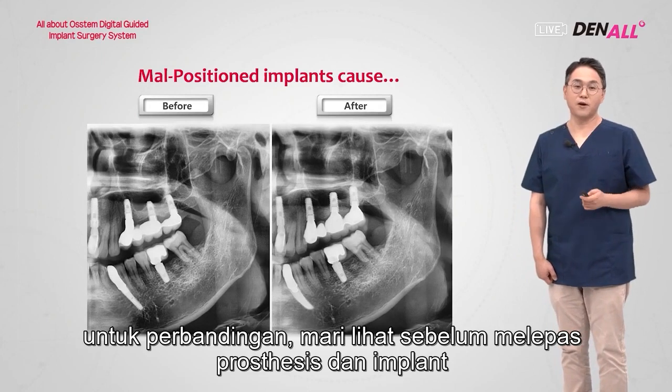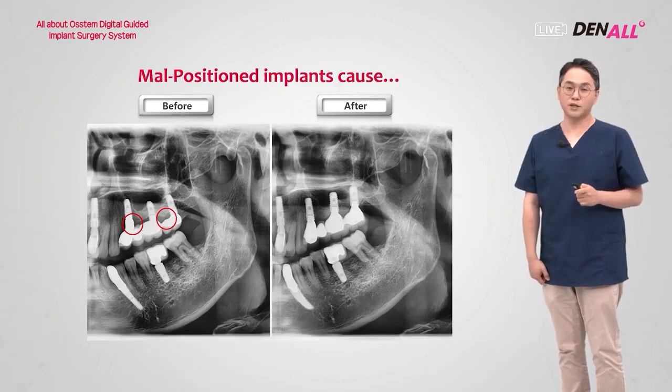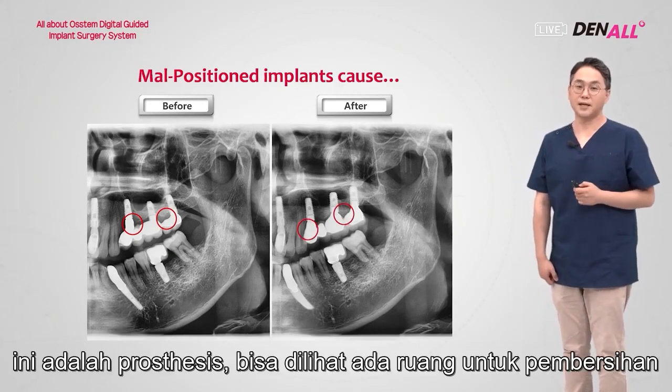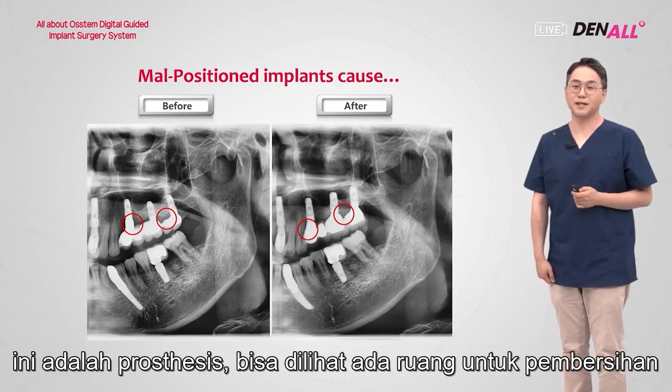To compare, let's look at before removing the prosthesis and implant. The implant has good mesiodistal position, buccolingual position, and placement depths. This is the prosthesis. As you can see, cleaning space is there.